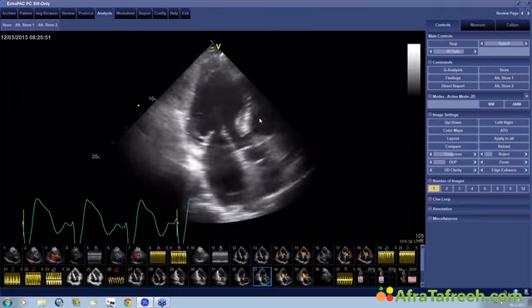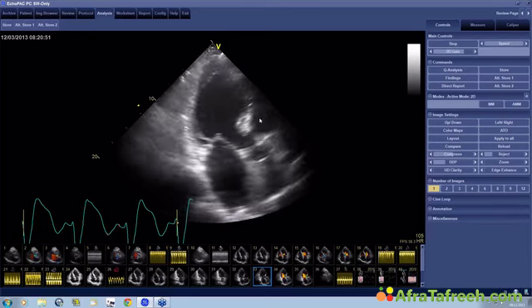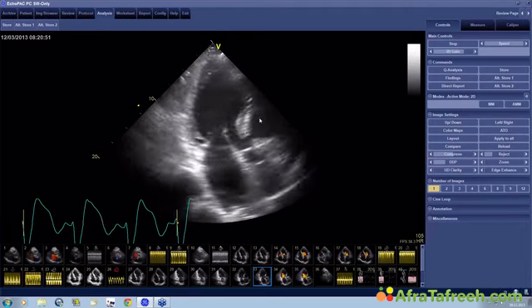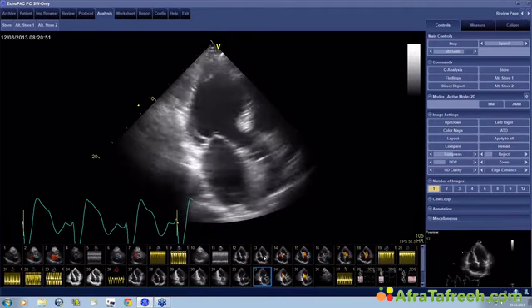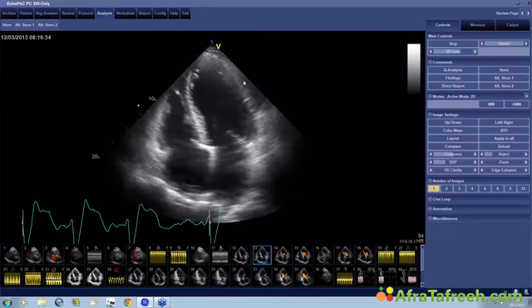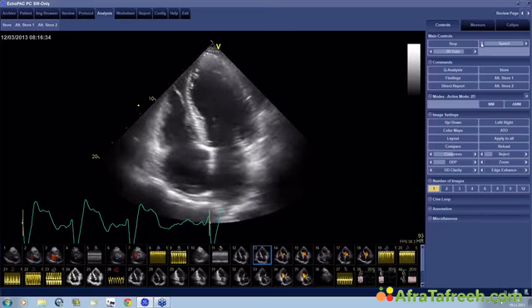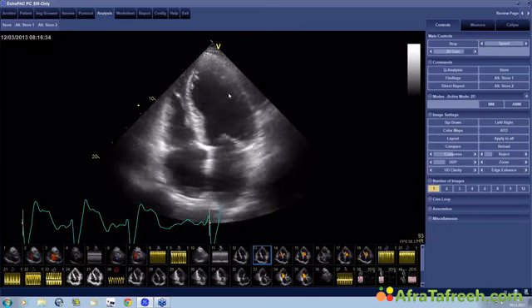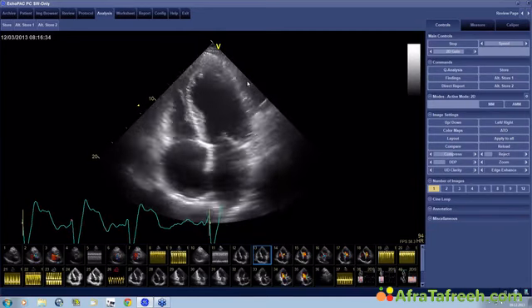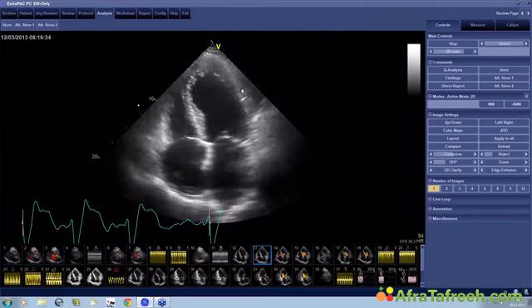And this is my take on this. I don't think these studies were really designed to show how good echo really is. I think the most important thing that you have to look at when you see these patients is just the way the septum moves. I think that if you are trained, it's very easy to detect dyssynchrony. And I'm sure that all of you will realize that this is a dyssynchronous motion. Once you've seen it, you will always remember how a dyssynchronous motion looks.